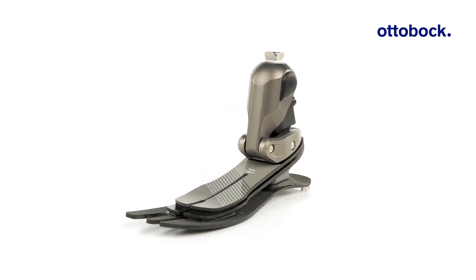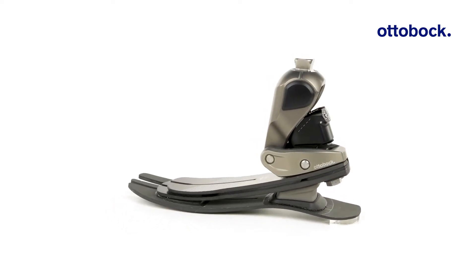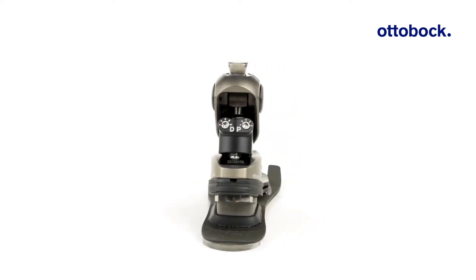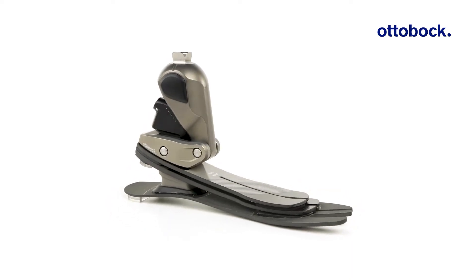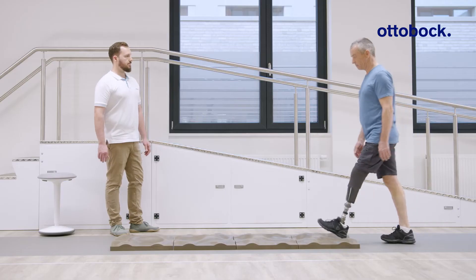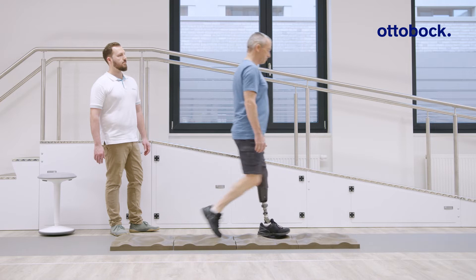In this tutorial series you will learn everything you need to know to successfully fit the Taleo Adapt. The Taleo Adapt was designed for active users who navigate varied indoor and outdoor environments. Its hydraulic ankle unit allows the foot to adapt to uneven terrain and slopes for greater flexibility and comfort.